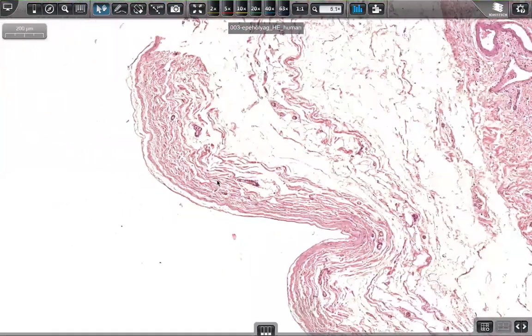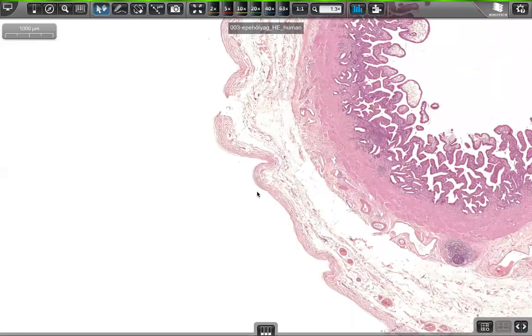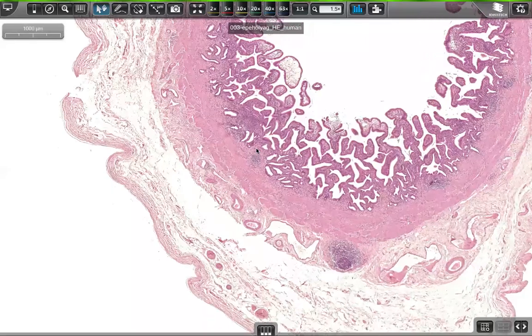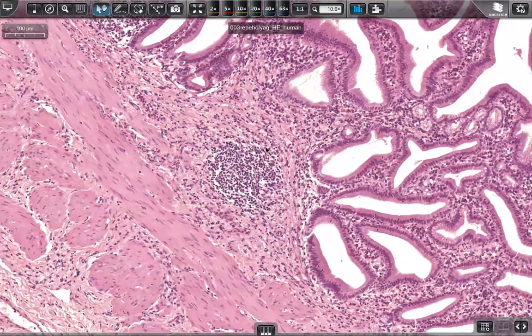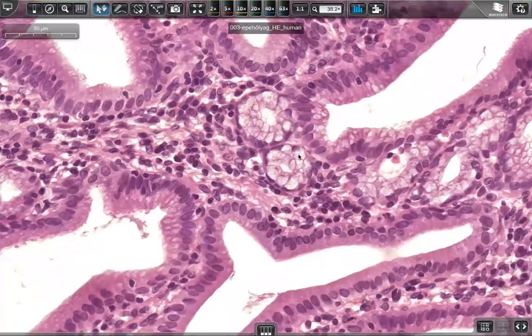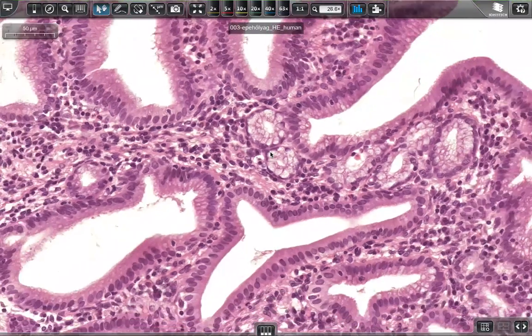So underneath we have a subserosa and connective tissue elements, but just because of the preservation, there is an artificial big gap. And definitely we can find some lymphoid infiltrations of the propria, and some glands are also present here. The cuboidal cells are typical for the glands.